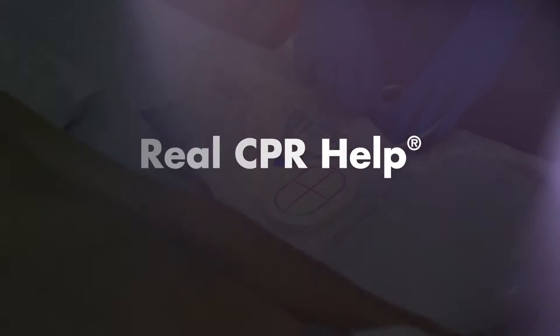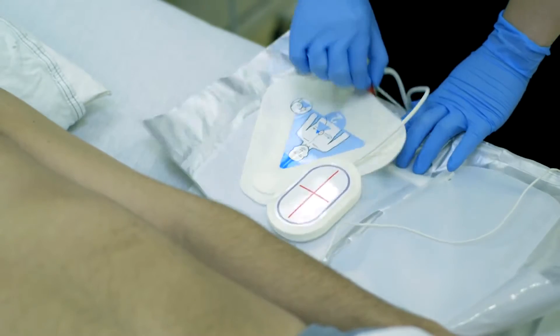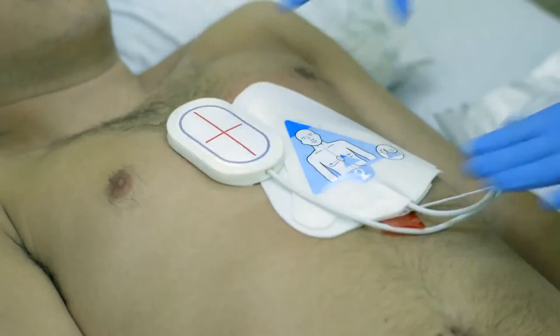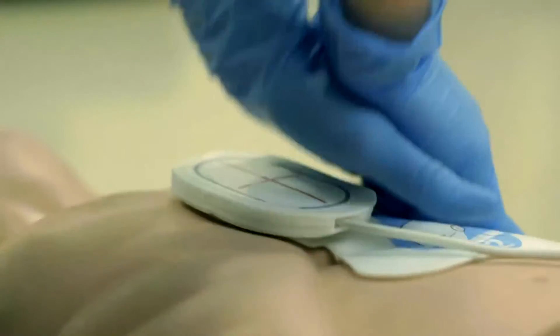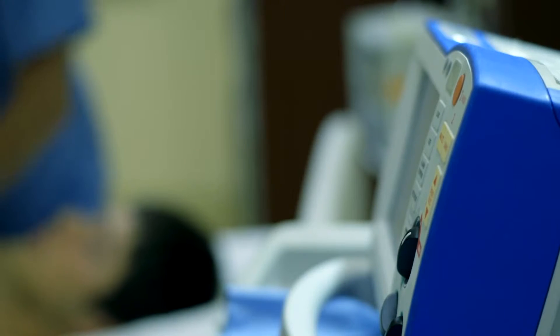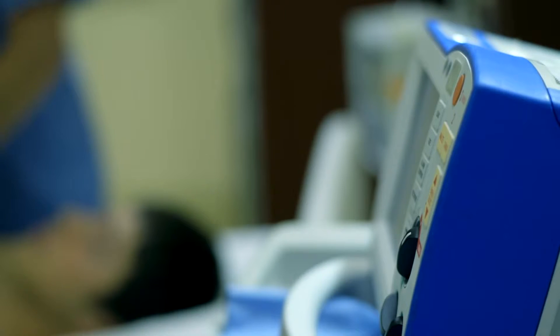Real CPR Help. For adult patients, the One-Step Complete and CPR electrodes include a CPR sensor. The CPR sensor monitors the rate and depth of chest compressions and sends this information to the R-Series. You should always use a backboard or CPR mattress when administering CPR.